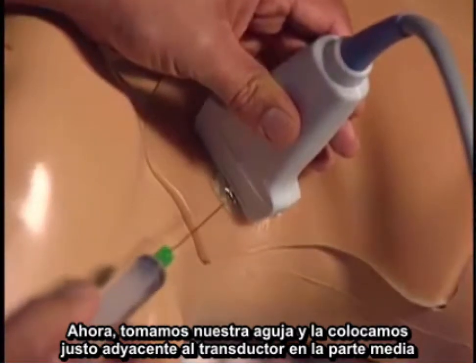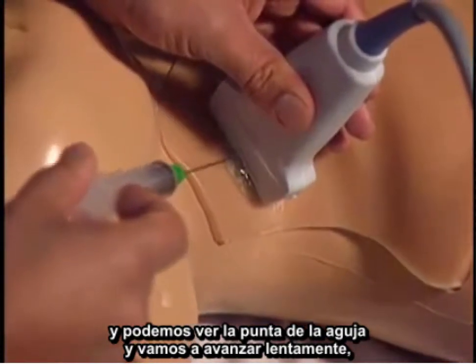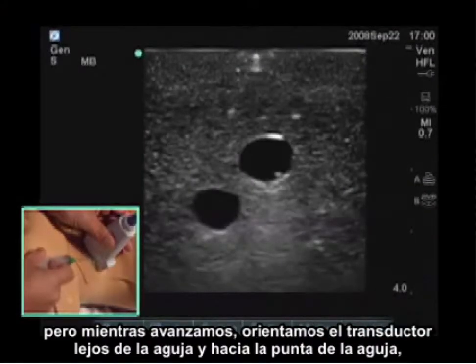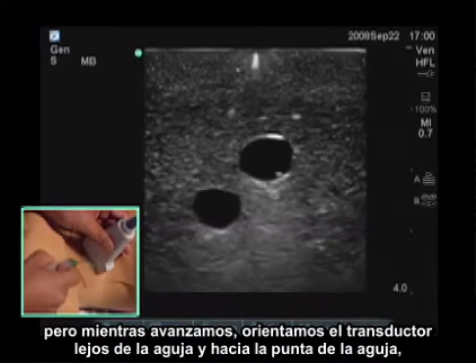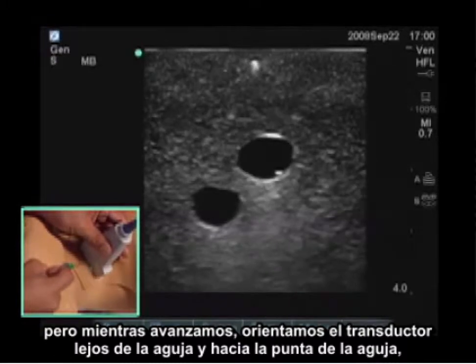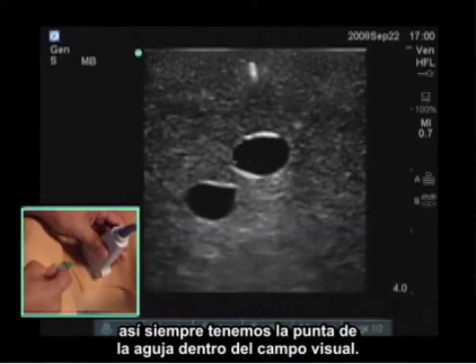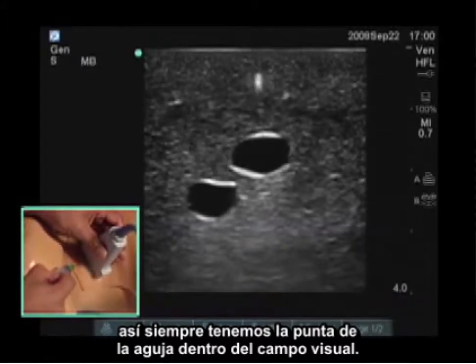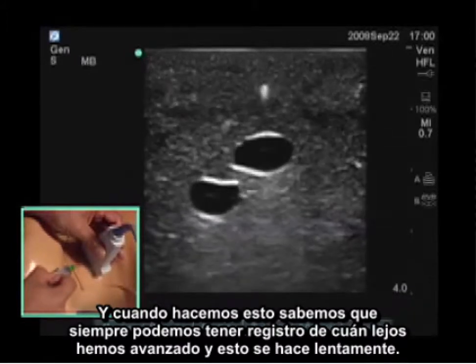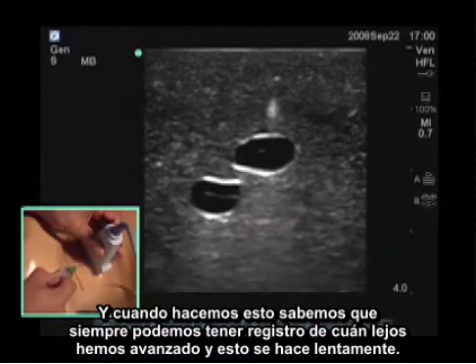Now I take my needle and put it right adjacent to the transducer in the mid part, and we can see the needle tip. And I'm going to slowly advance, but while I'm advancing, I'm angling the transducer away from the needle and toward the needle tip. So I always have the needle tip in the field of view. And when I do that, I can always keep track of how far I've gone. And I do this nice and slow.